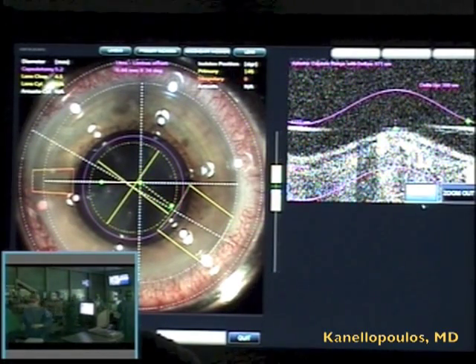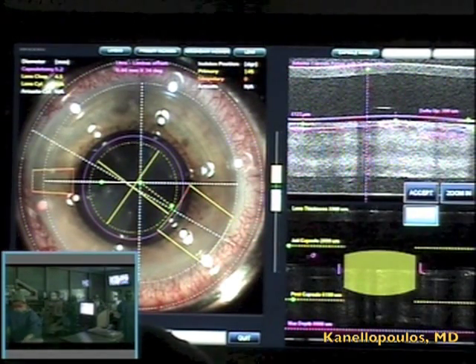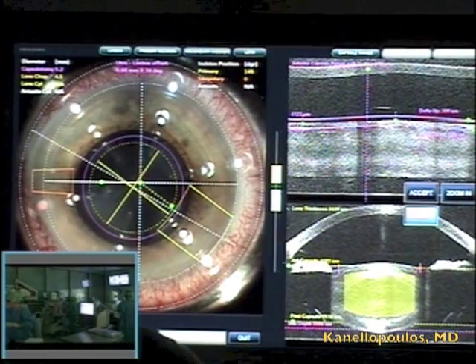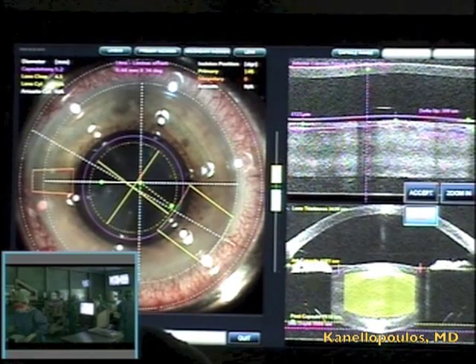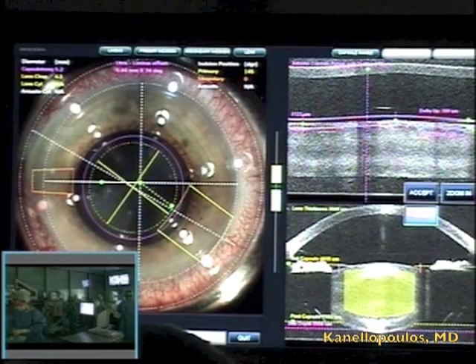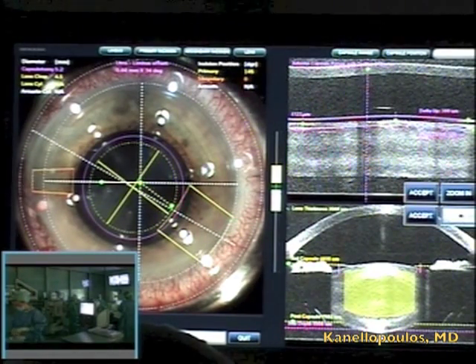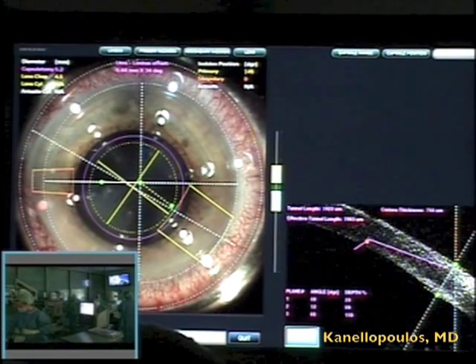We've had over the last year some issues with obtaining a complete capsulorrhexis in most cases. Up to now we've performed a dozen cases with the soft fit. Every single case has had a free-floating capsulorrhexis. Here, as you can see, I'm adjusting the lens fragmentation to come more anteriorly, almost under the capsule. This is not a problem because my capsulorrhexis is wider than the actual lens fragmentation, so there's no risk of the lens fragmentation creating radial anterior capsule tears.